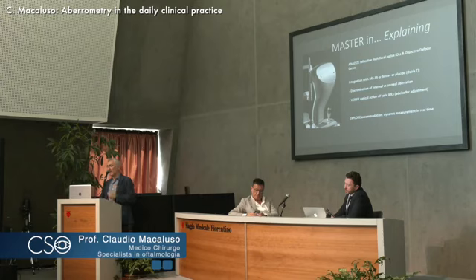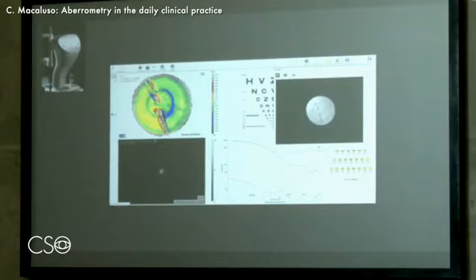And then the dynamic measurement we've just seen in one of the last slides by Francesco, we can explore even accommodation, which is a pretty fast phenomenon. This is an example just to familiarize you with one of the main windows that we deal with when using the instrument. This is the visual effects.